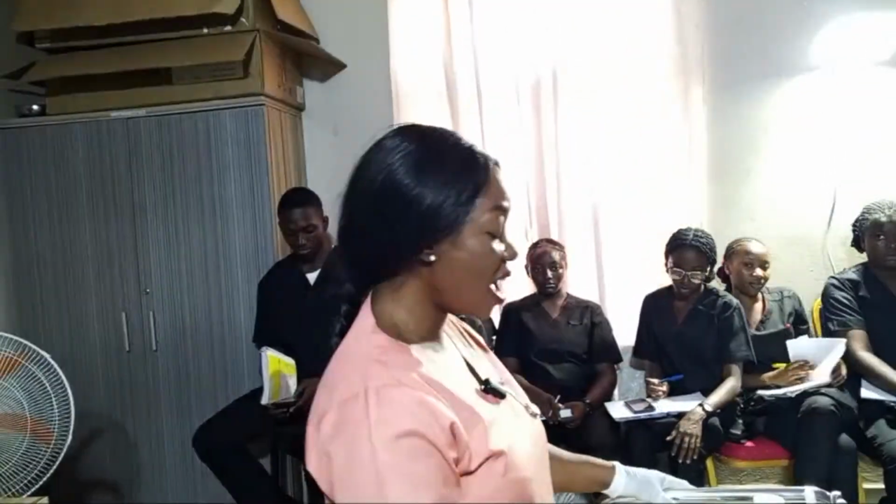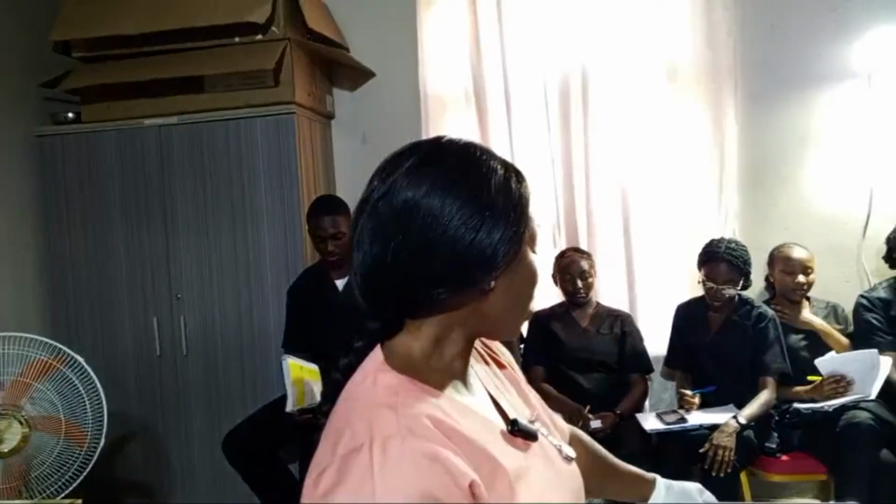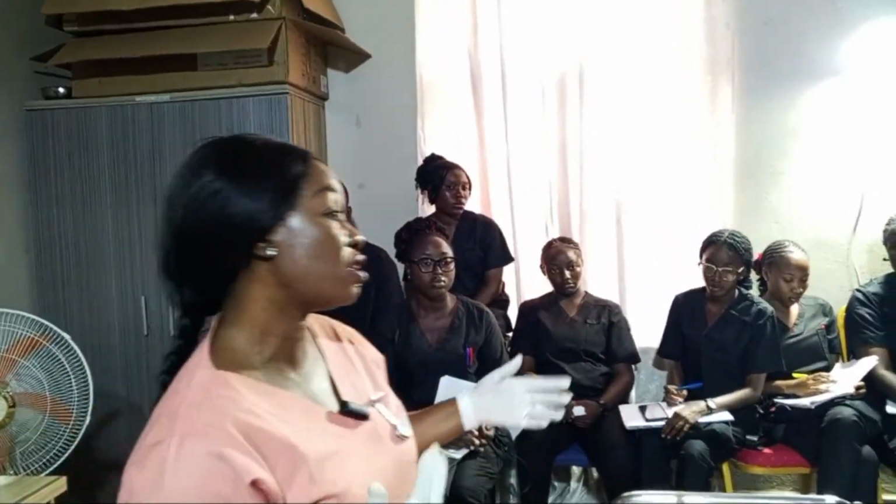So can you tell me what we've done today? Can I ask you a question? Since you don't want to ask me, who can tell me, class? Who can tell me what you are expected to do as the first step in urine testing, when you are going to carry out a procedure? Okay, you first of all perform hand hygiene, right?